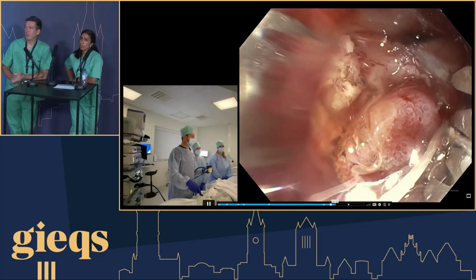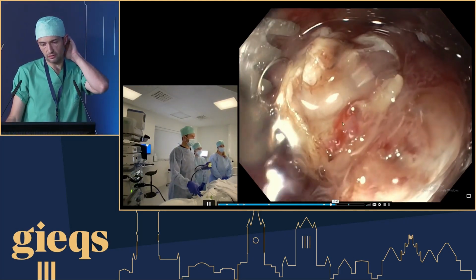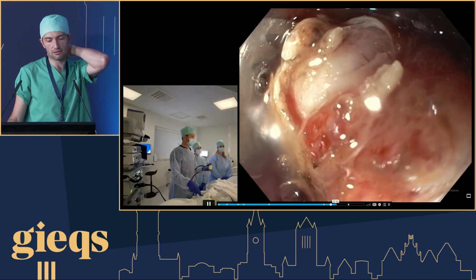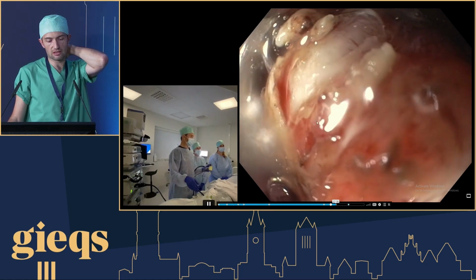Well, that's it. But I think you can test that if you have a cap on the endoscope. You can test whether you're going to get suction or what else you need. You also have the other devices, the anchor and whatever. But Michael was right, Amir was right. This is a huge blood vessel in this area. And so we suction it into the cap.